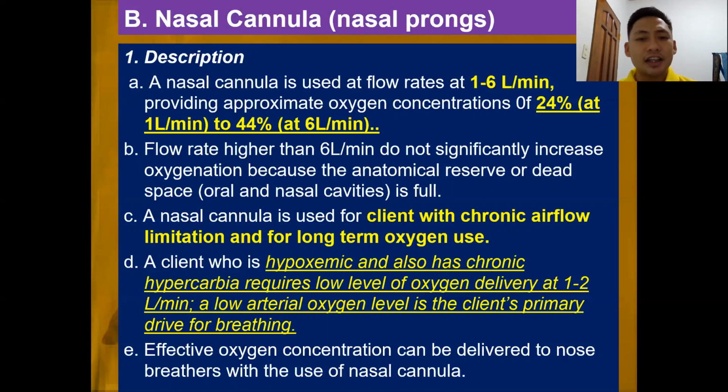A nasal cannula is used for clients with chronic airflow limitation and for long-term oxygen use. One of the advantages of a nasal cannula, of course, is that you can speak, you can talk. It is more convenient because you can eat. It's not suffocating to the patient.